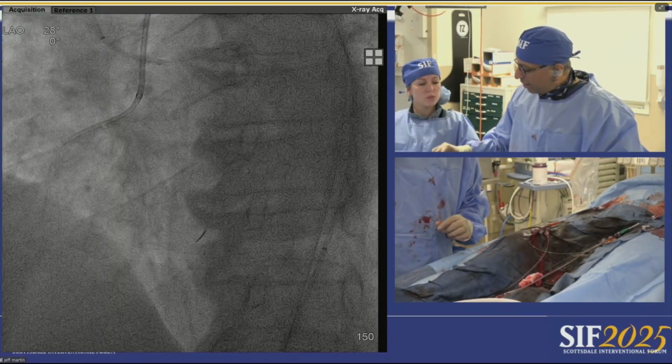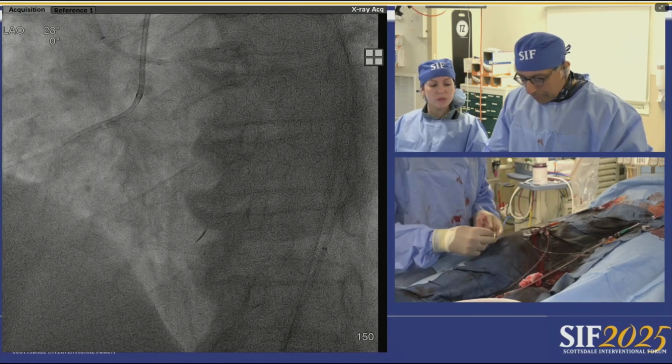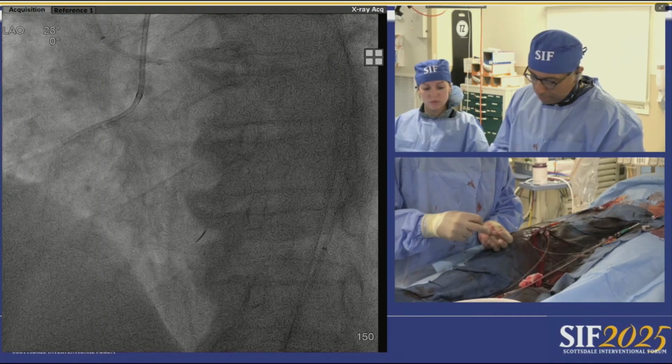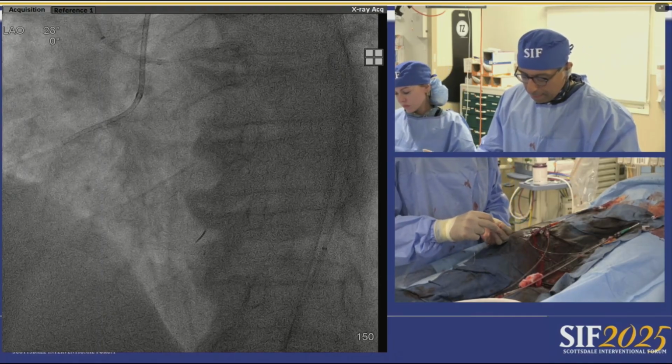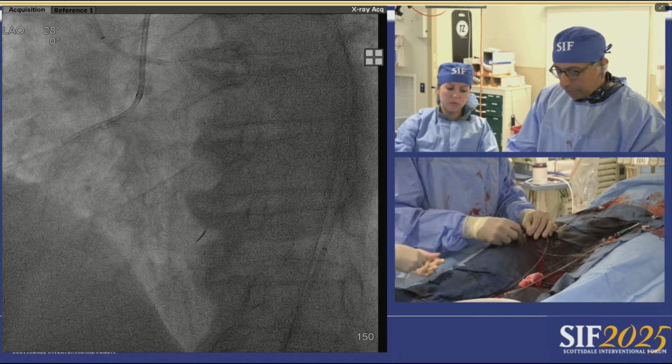And like anything, this ended up looking very easy. That's great. It's wonderful when it goes smooth. Often it won't. I think the important thing for everybody in the room is if you want to learn to do this, you can. But you have to put in the same level of commitment and work and coaching and risk and building skill sets to get there.